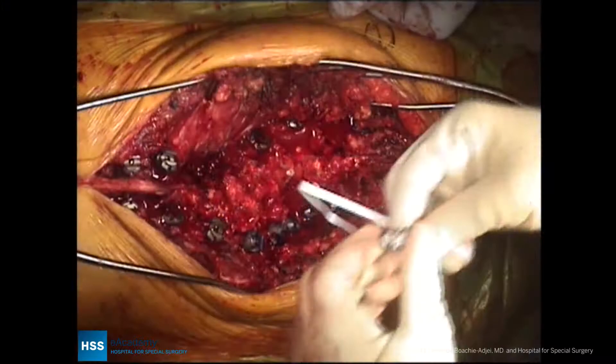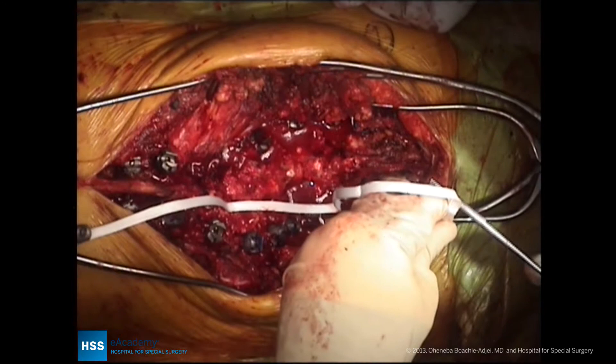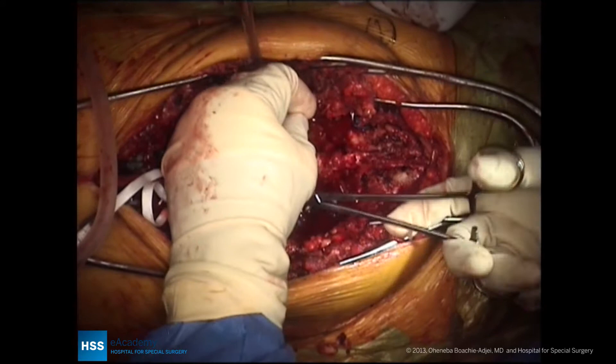Now, what is being done here is that having completed the Smith-Petersen osteotomies, we are passing universal clamps. The universal clamps are being used for the apical vertebra, which will aid in translation of the apex of the spine to the concave rod, so that we don't have to worry about pulling out pedicle screws placed on the concavity, which will be very far from the concave rod.